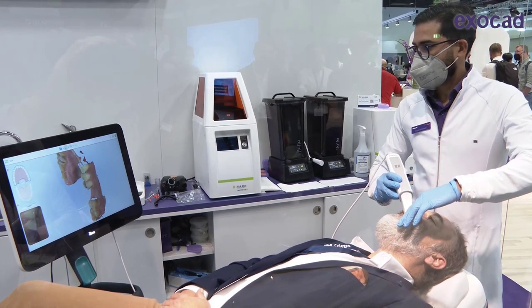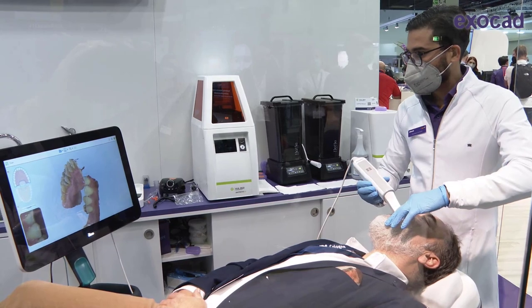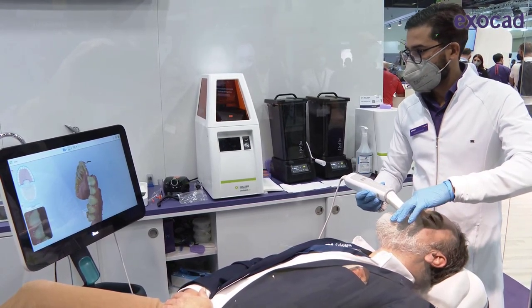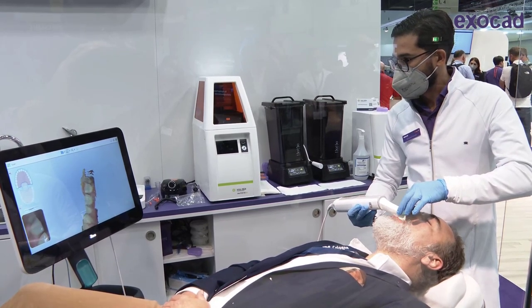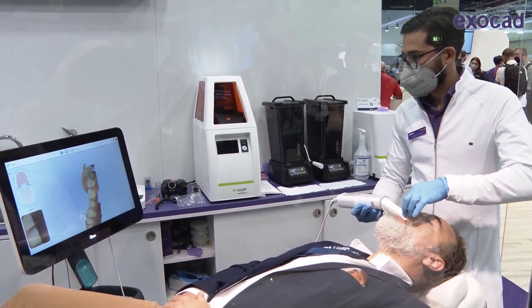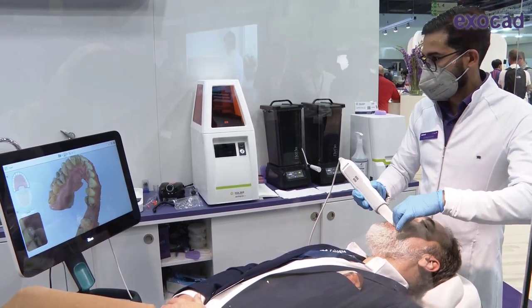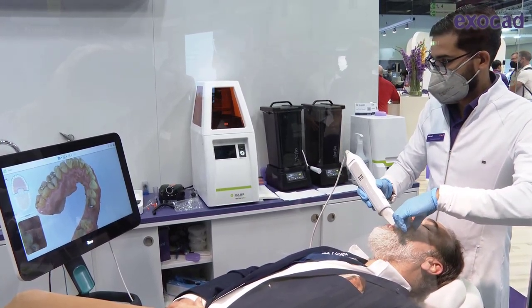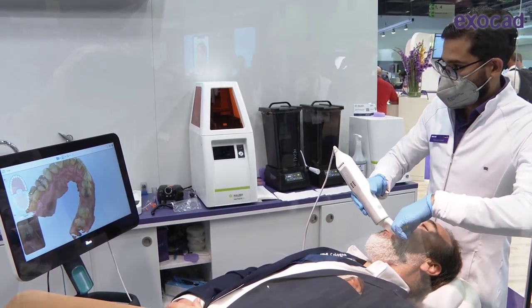You don't have to worry about saliva or drying — we don't use any scan powder or similar; you don't really need any of that. It's a fully optical system including near-infrared technology, which also allows for caries detection, especially for first visits. So it's an all-in-one device — no special procedure needed, it's all done in the same scan.